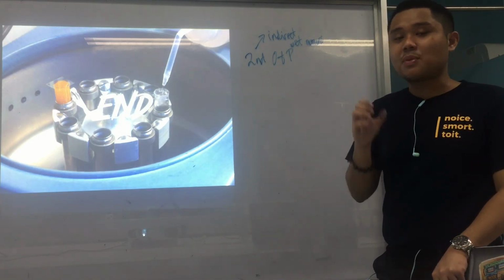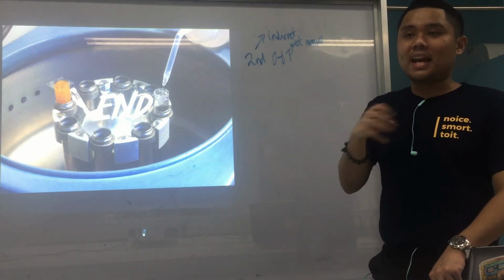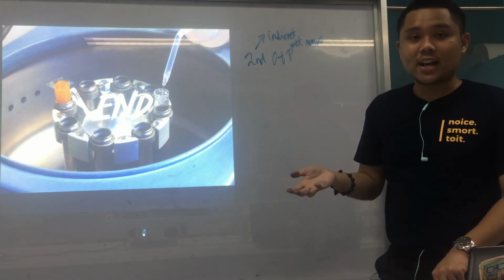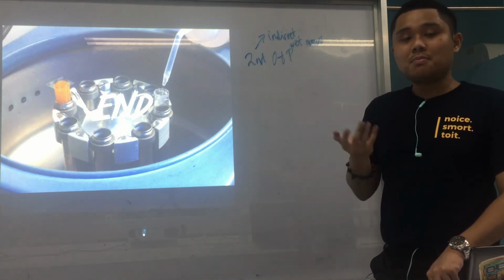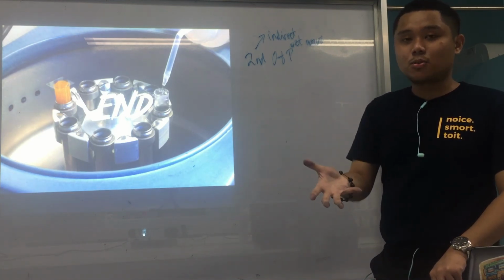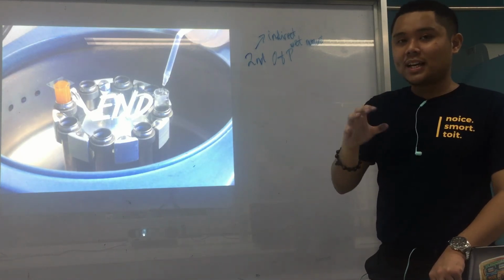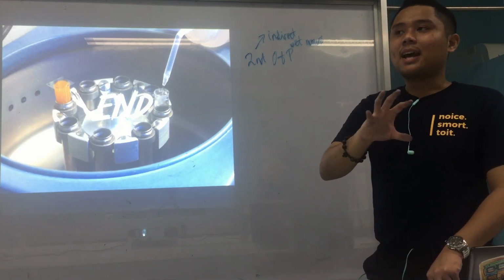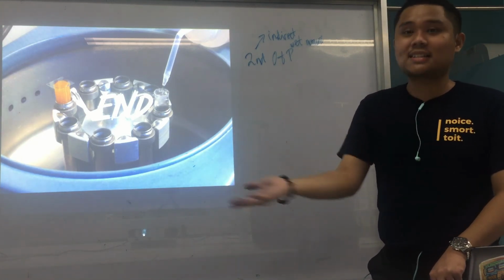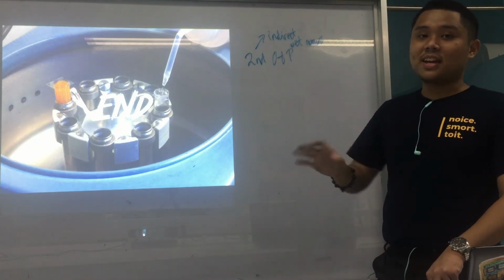It is very, very important that we perform concentration techniques, especially in light infections, meaning infections that can lead to a false negative reading of direct fecal smear. Light infections mean that the number of parasite eggs that can be found in the stool sample could be very little. Because it's too little, we can miss the parasite eggs when we examine under direct fecal smear. So that's the importance of concentration techniques.